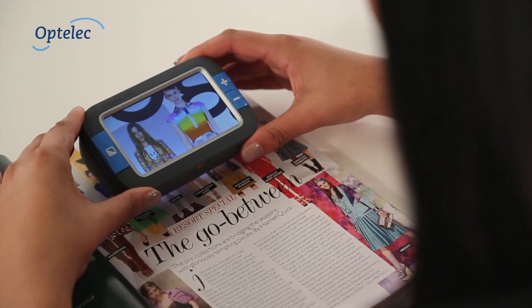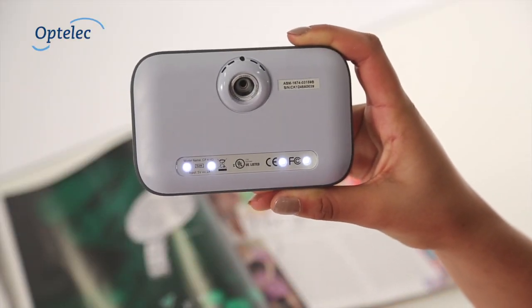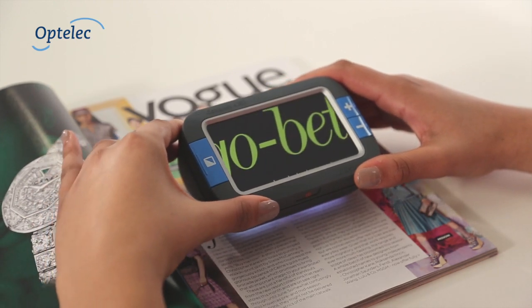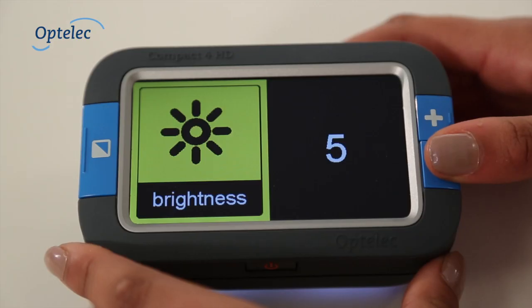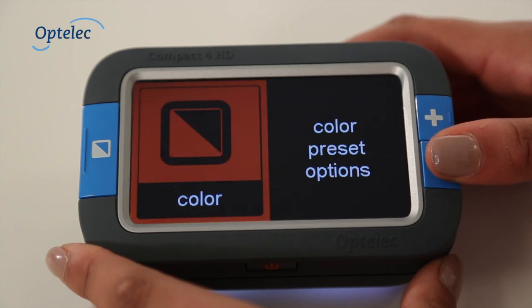The Compact 4HD produces a sharp and clear image thanks in part to the patented LED lighting system to best maximize your reading needs. Operating the Compact 4HD is extremely simple thanks to the visible controls on the display. You can also customize your own reading settings with a special large icon menu.